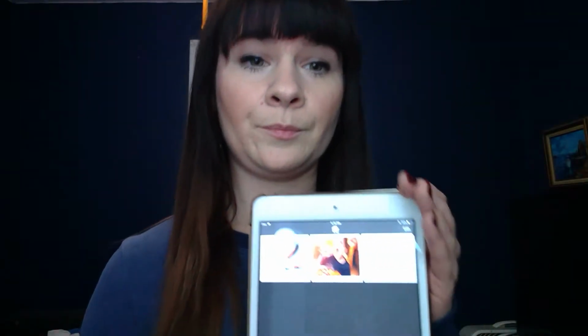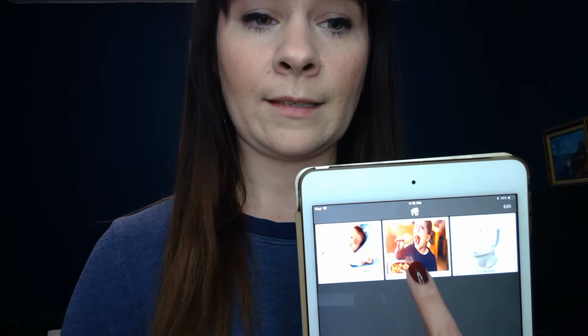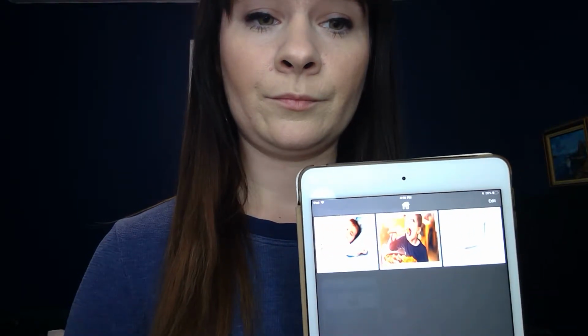So how I would use this with a client is, for instance, if they want to eat, I would have them press eat. Eat. And I programmed it to where my voice is also relaying exactly what the image is, because I know that can promote more spontaneous language and also help them understand what that term means when they hear it. So it may also promote better communication with and without the AAC device.